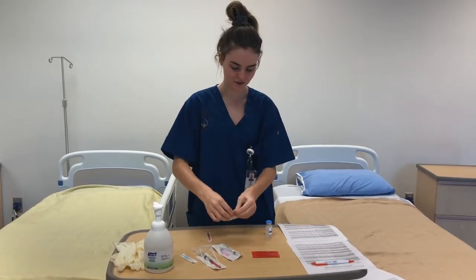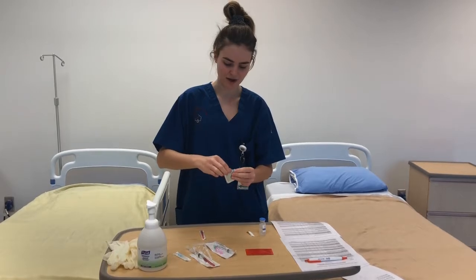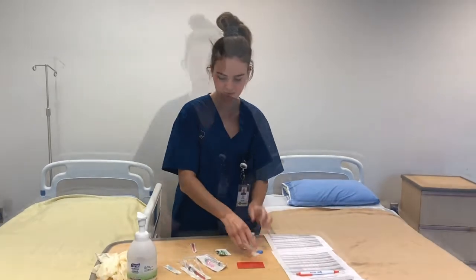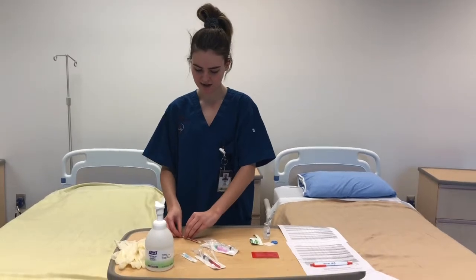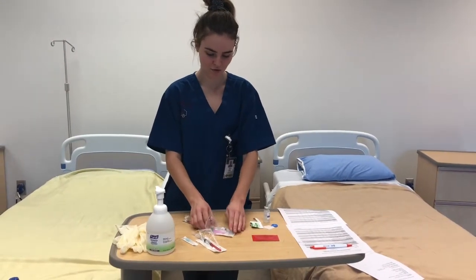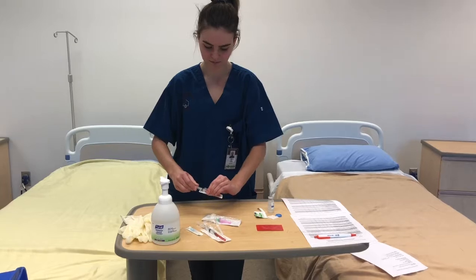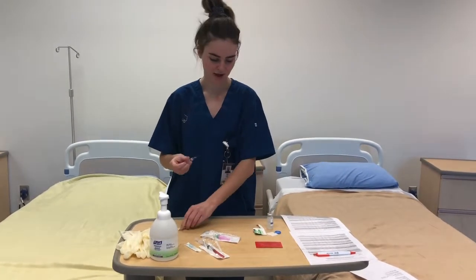So first I'm going to get an alcohol pad and wipe off my vial so that it's sterile. Okay, so now I'll be opening up my 3 milliliter syringe and my 21 gauge needle. So getting my syringe, I'm going to be luer locking the needle to the syringe and pulling off the cap like that.